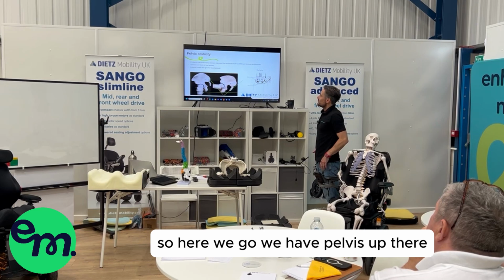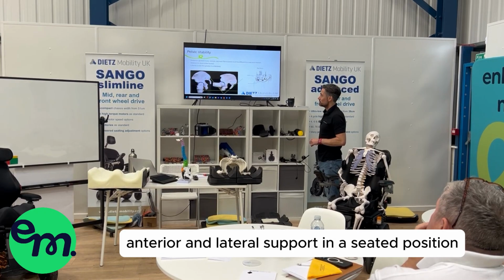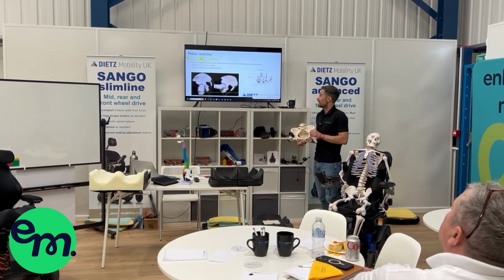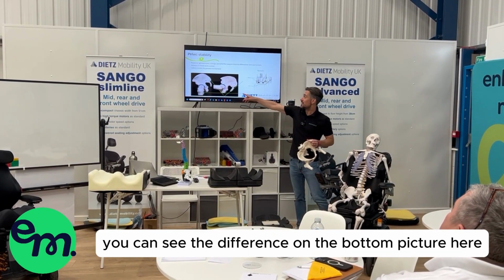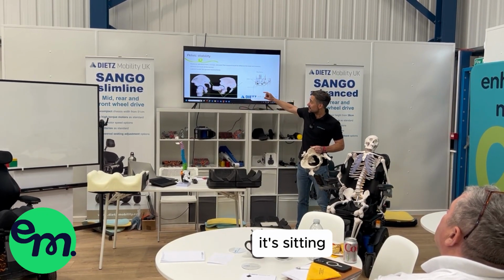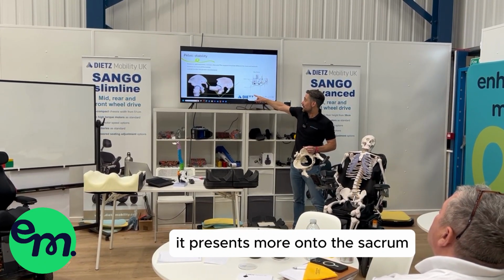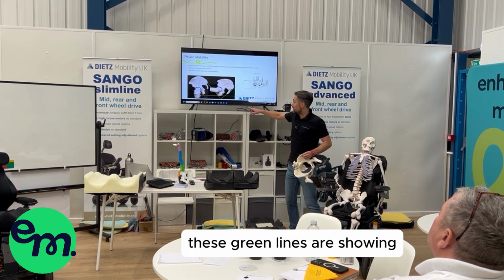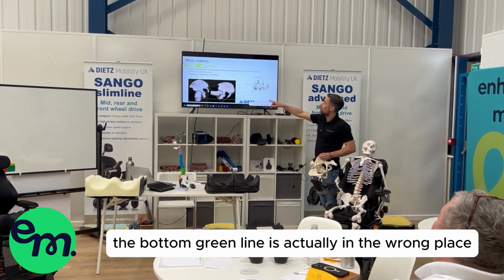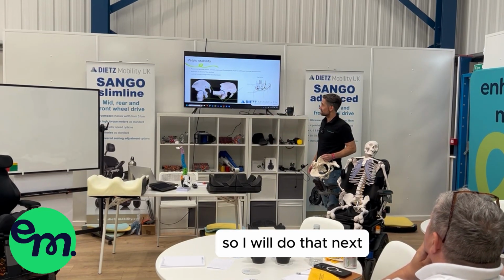So here we have the pelvis up there. For pelvic stability, we need posterior, anterior and lateral support in a seated position because the pelvis is a 3D structure. You can see the difference on the bottom picture between a pelvis when we're standing upright and a pelvis that's sitting. You can see that little bit of posterior tilt as we close that hip angle down. It presents more onto the sacrum. These green lines are showing where we need to get that additional support. The bottom green line is actually in the wrong place. It needs to be at the trochanter. I will do that now.